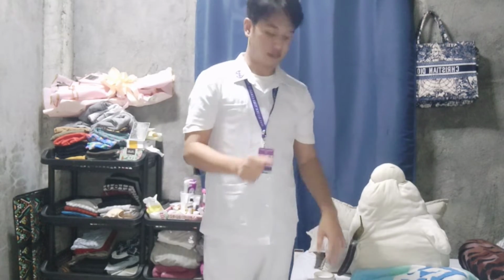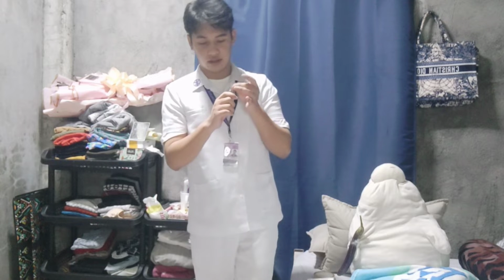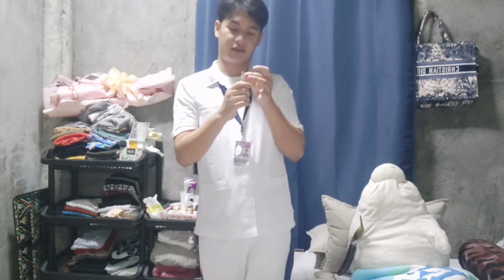Next, we need to prepare the medication ampule for the drug withdrawal. Flex the upper stem so that the medication that is stuck here will go down below the stem.